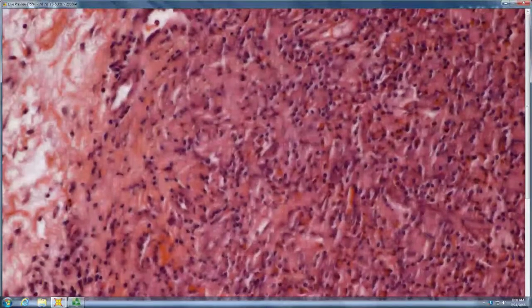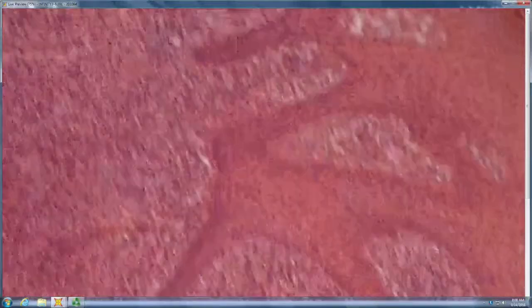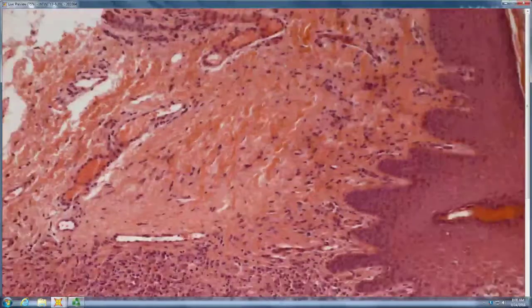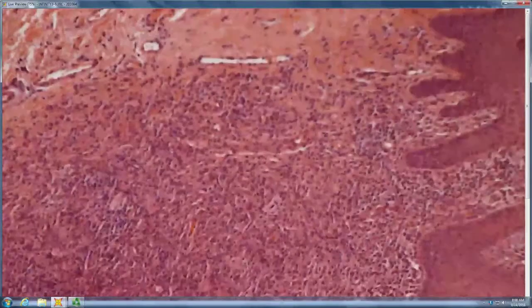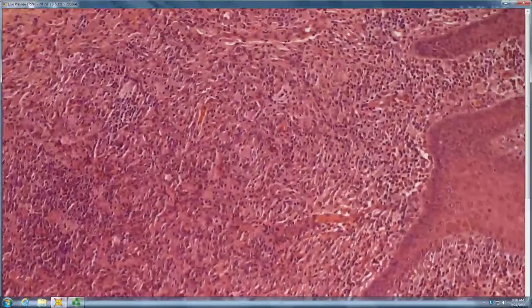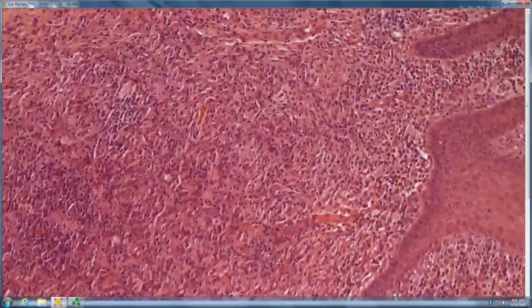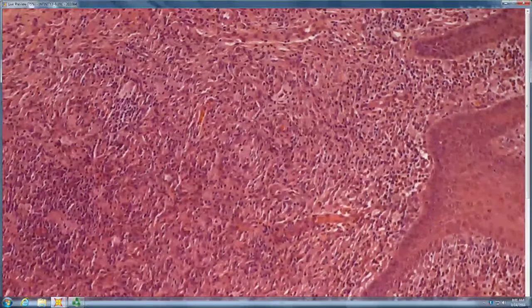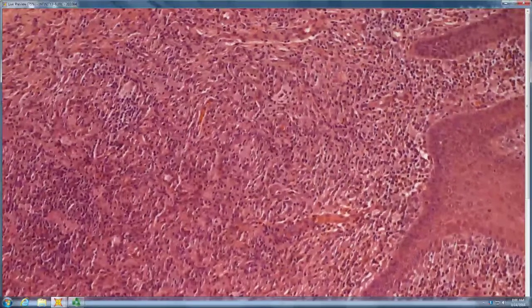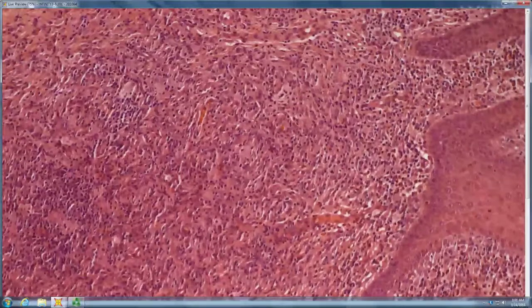So what kind of things would give you eosinophils on a background of histiocytes? I'm not sure. Do you know any kind of granuloma that's eosinophilic? So eosinophilic granuloma could be one, right? So it could be in the more granulomatous end of a Langerhans cell histiocytosis spectrum.